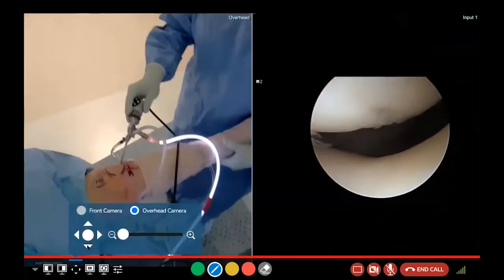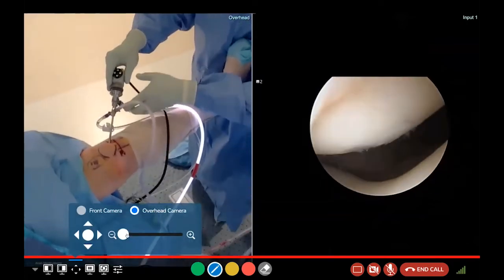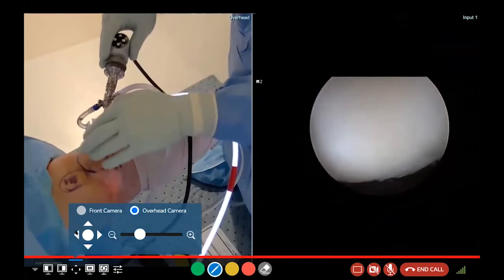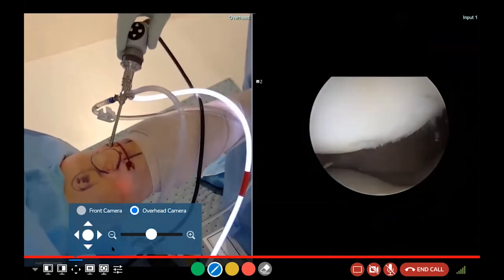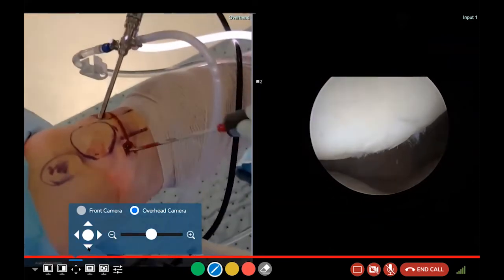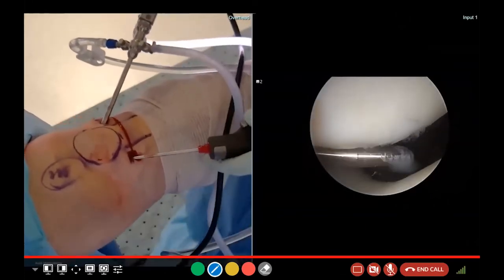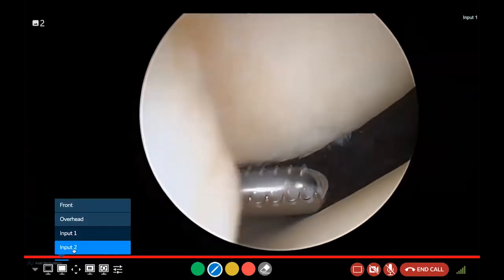I'm going to go back to the kneecap. I said the kneecap showed that area of cartilage damage. I am underneath the kneecap — that's the kneecap on top. I'm going to bounce it with my fingers. That's the trochlea underneath. I'm going to do that mowing the grass — just smooth out that cartilage staining, which is the best I can do to help prevent mechanical symptoms. I'm not really improving arthritis here.